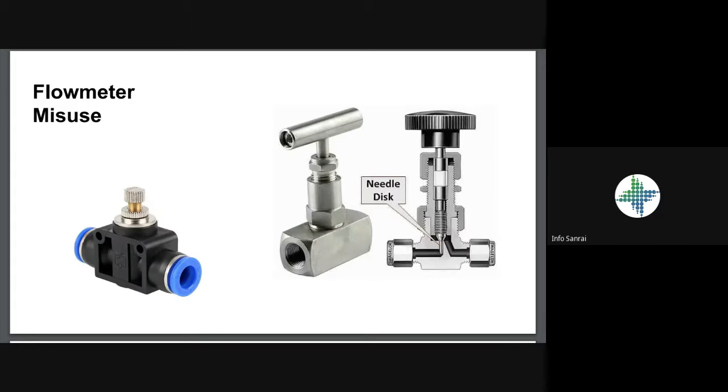So this is an important problem. It has clinical impact on patients if they're receiving low purity oxygen because the flow rate is exceeded above the maximum level. And this is a fairly inexpensive modification, but of course it should be done by a trained technician. So Maui, I'll pass it back to you. Thank you.